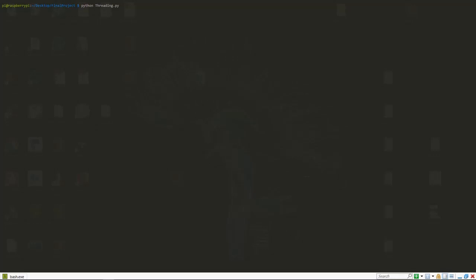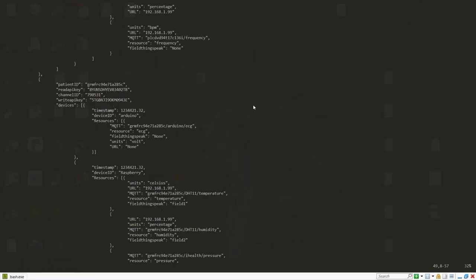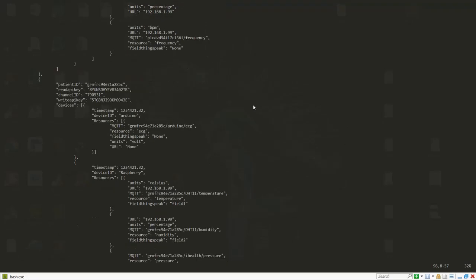In all the tests we made till now, devices did not register to the catalog, and the catalog did not delete the devices with a timestamp older than 2 seconds. If we had run the scripts that refreshed the devices, the non-existing devices would have been deleted, so we would not be able to demonstrate that the whole system can work with more than one patient. Now we will run the script where the catalog refreshes the device patient and receives the subscription from the only 2 devices we have for this patient. Now we will see that in the catalog we have 3 patients, each of these patients with 2 devices related.